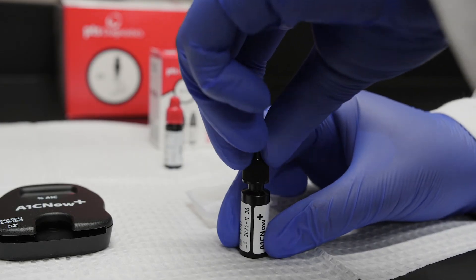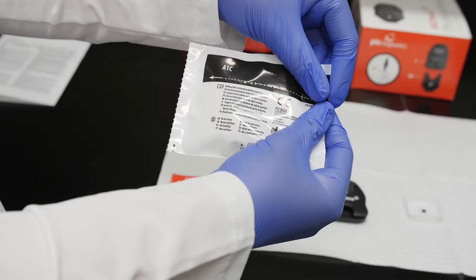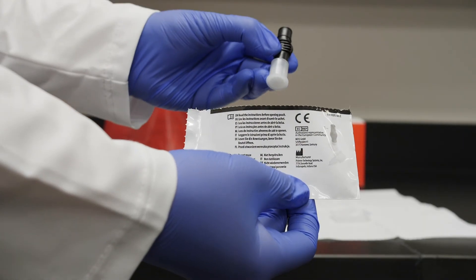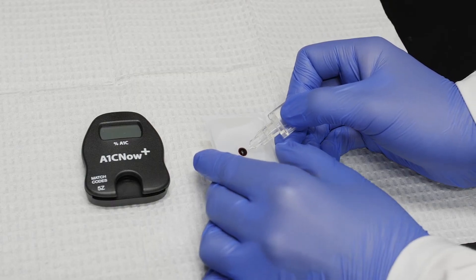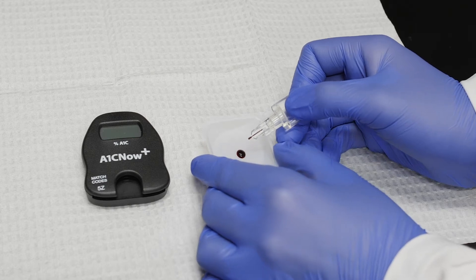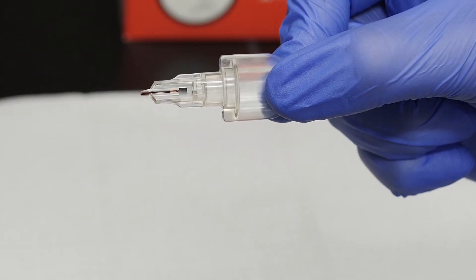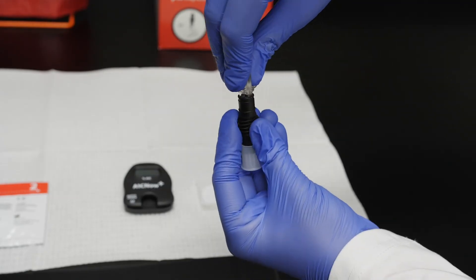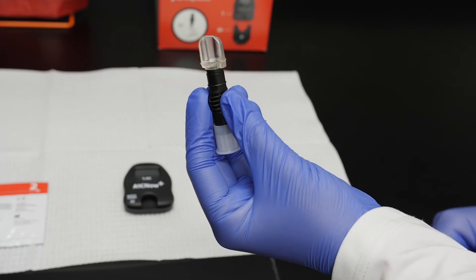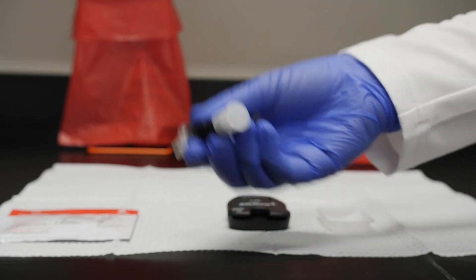Immediately replace the lid on the vial. Once opened and thawed, A1C Now Plus control solution cannot be placed back in frozen storage. Open the shaker pouch from your A1C Now Plus test kit. Hold the blood collector at a 45 degree angle and collect the A1C Now Plus control solution from your clean, flat surface. Verify that you've collected the appropriate amount of control solution with the blood collector. Insert the blood collector into the shaker body using a twisting motion. Shake vigorously six to eight times, then stand the shaker body on the table.